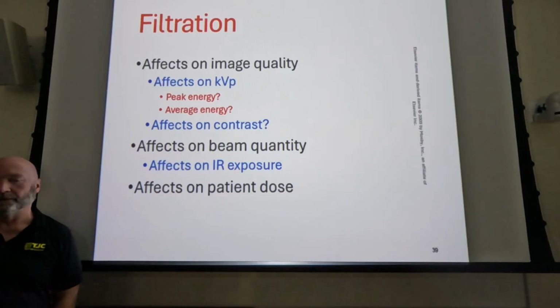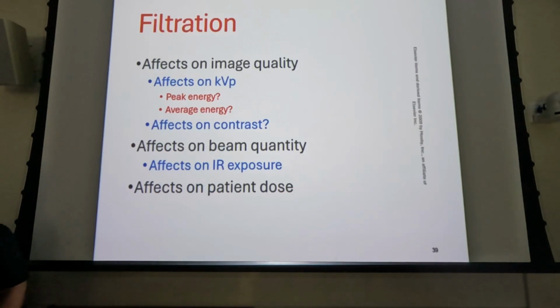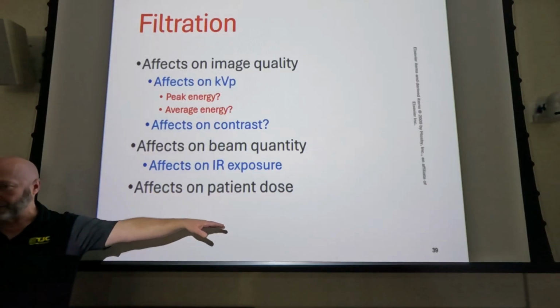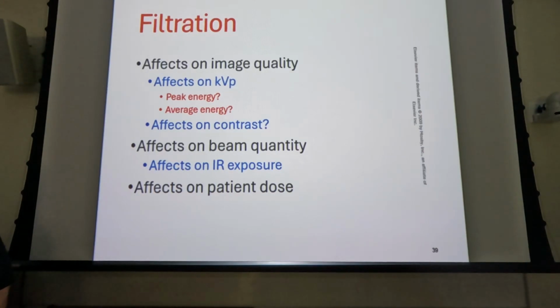Effects on patient dose, though. We have a higher energy, more penetrating X-ray beam. What type of interactions increase the patient dose the most? You've got three. You get scatter radiation, which is partial absorption. You have penetration without interaction. You have total absorption. Which one of those three adds most to the patient dose? Total absorption, right? So if your X-ray beam is more penetrating, what should the effect be on patient dose? It should go down, right? So it's a better beam for the patient.